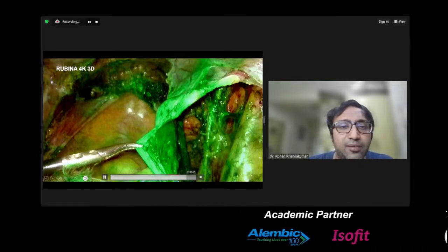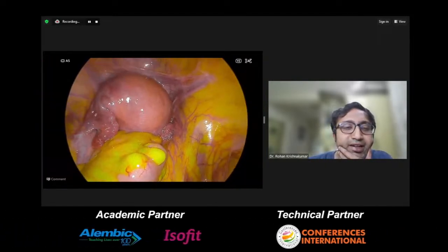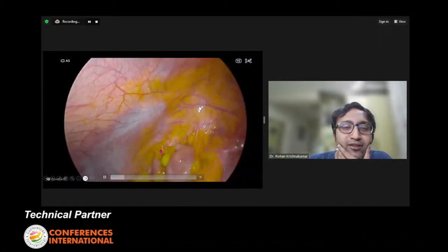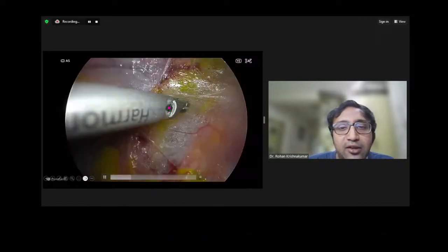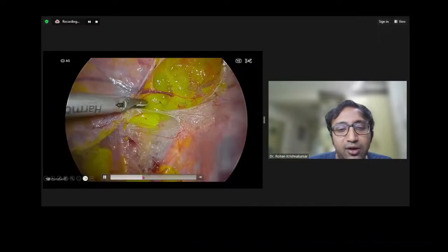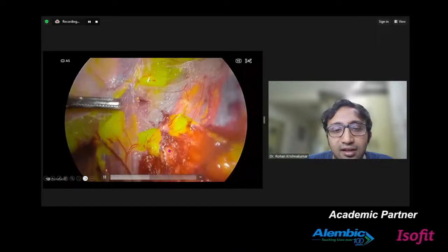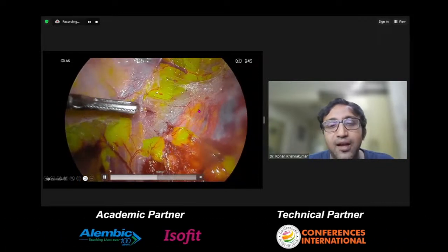Going ahead with other imaging systems that are now available. This is a new camera that we very recently tried for our surgery. It was really good. You can see there's something called a fat enhancing mode, which also works on infrared technology, and it is reflecting more light on the fat. Once the retroperitoneum is opened, you can see all the fat looking more yellow compared to the other structures, and so is the fat on the ureter.